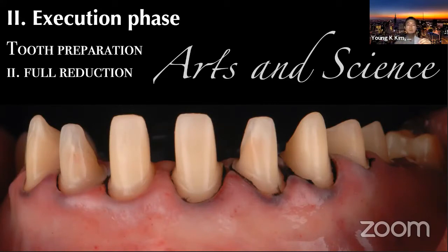And on the anterior tooth, I almost always perform the bone sounding, which is probing all the way to the crestal bone, on the midfacial especially, where we can't really visualize on the x-ray. And if it's more than 3 millimeters, I tend to prep a little deeper on the subgingival area to prevent any of the margin exposure later, which is quite commonly seen.